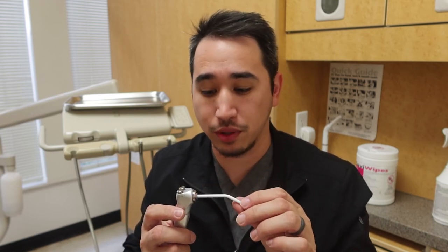If you find that this isn't the type of piece that you have in your office, go ahead and check out my other video that has the friction type of holding for the air water syringe, and that will go through the same process of repair.